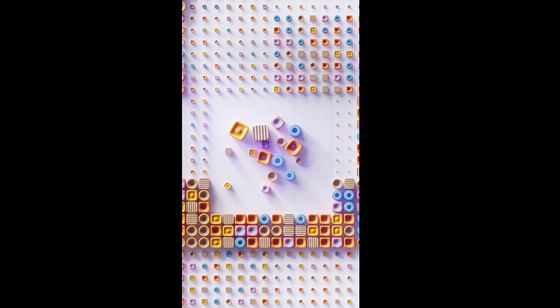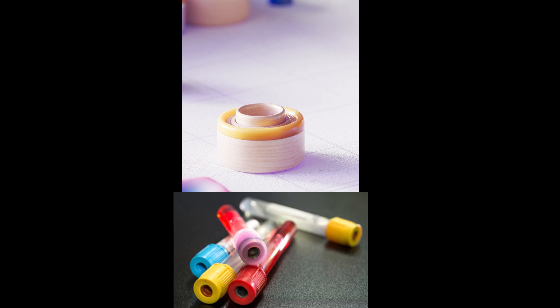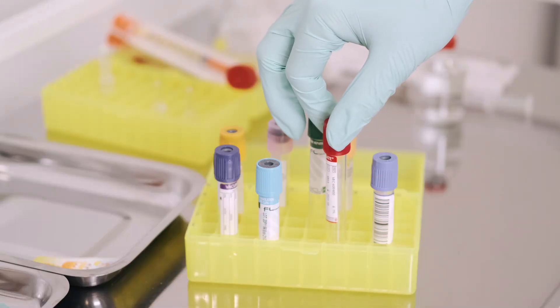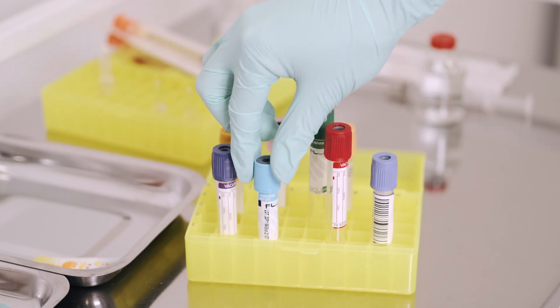Have you ever noticed those colourful tubes we use for blood collection? Each one has a different colour cap — red, blue, green, purple, yellow, grey. You might be wondering why so many. Well, those colours aren't random at all. Each tube actually has a special additive inside that helps with a specific type of test. Today, I'm going to break it all down for you, vial by vial, in the simplest way possible.